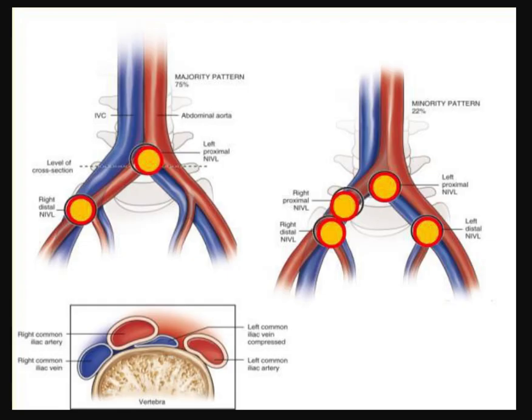Today I'm going to show you how to look through your CT scans to see if you have May-Thurner physiology. May-Thurner physiology refers to a specific pattern of compression between the artery, the vertebra, and the venous system.